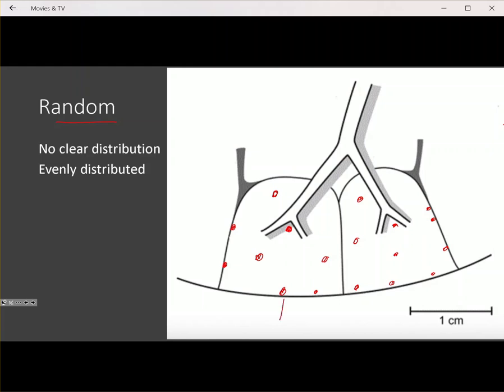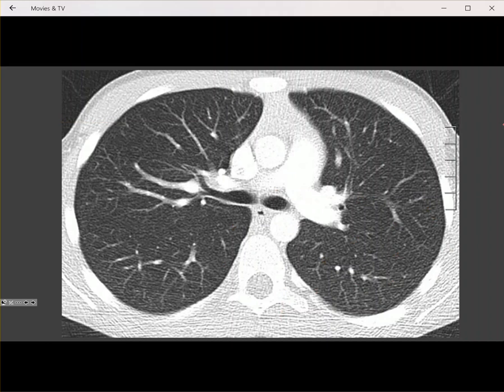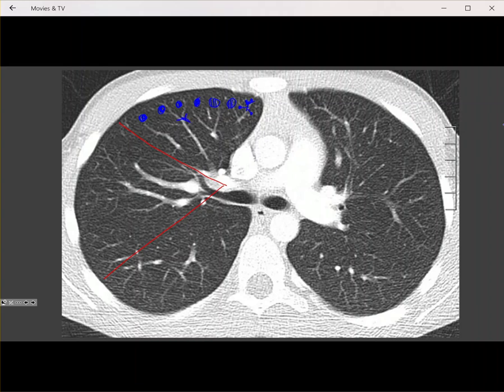Like perilymphatic nodules, random nodules will involve the visceral and pleural surfaces. On a diagram dividing the lung into thirds: centrilobular nodules are evenly spaced from each other, could be solid or ground glass, or have this branching tree-in-bud appearance. Notice that with centrilobular nodules they're evenly spaced and spare the visceral and pleural surfaces.